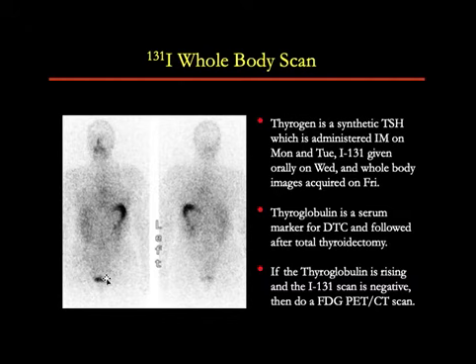Now, Thyrogen is a synthetic TSH which is administered intramuscularly when we do a Thyrogen stimulated I-131 scan. Now, this is administered on Monday and Tuesday. I-131 is typically given orally on Wednesday, and the whole body images are acquired on Friday.